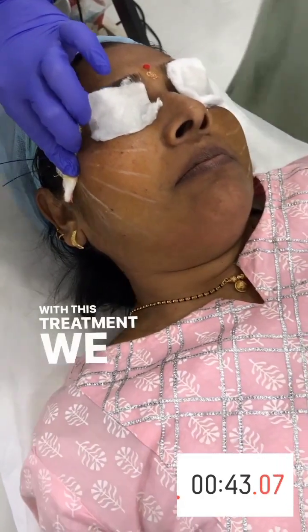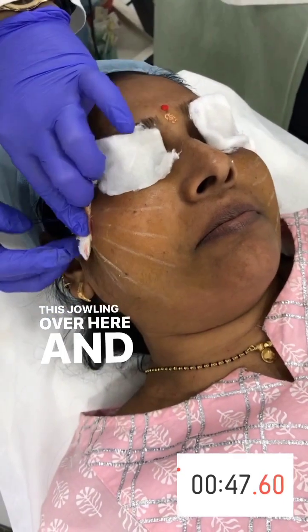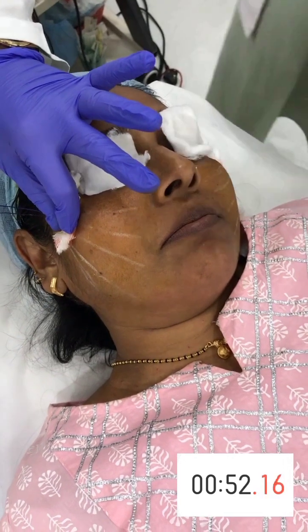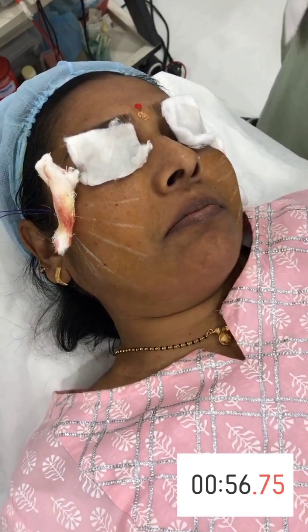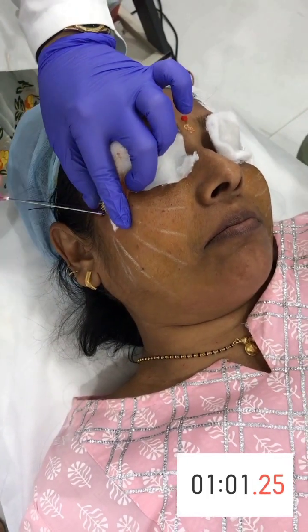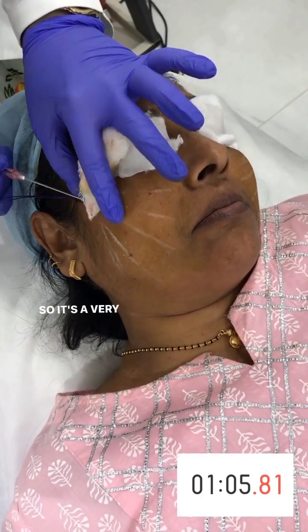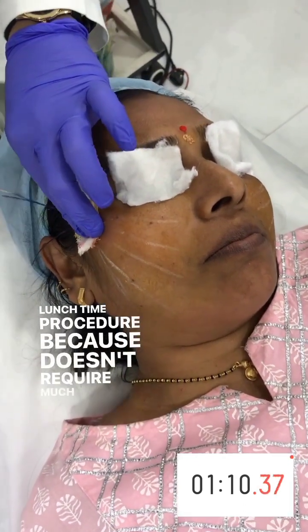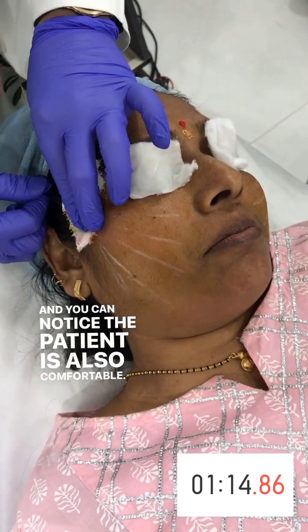With this treatment, we are trying to target the smile lines. There's jowling over here, and we'll be giving a little definition to the jaw. It's a very simple procedure, and it's sometimes called a lunchtime procedure because it doesn't require much time. And you can notice the patient is also comfortable.